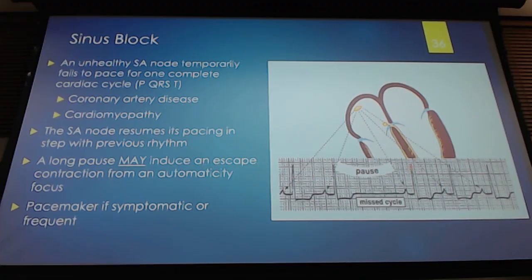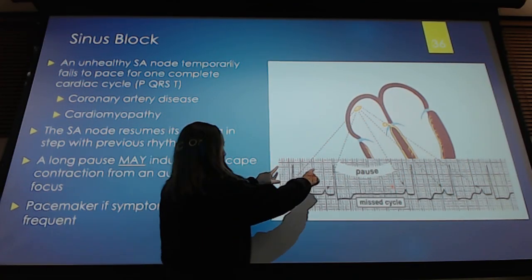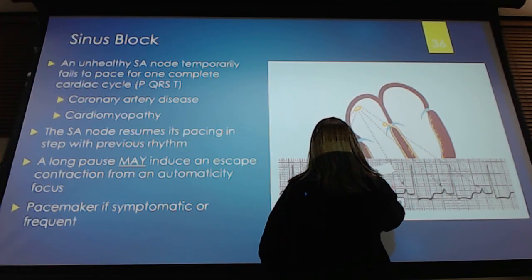Well, you could have atrial escape rhythms, so that's P waves. You know it because as you're marching this out, it's exact. So meaning I come here, and if it were an escape, it's not going to be exactly the right spacing away. So what I mean is if I march this out, I go here to here, I should hit right in the middle.